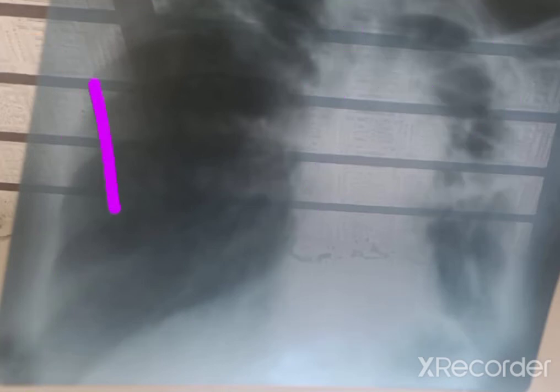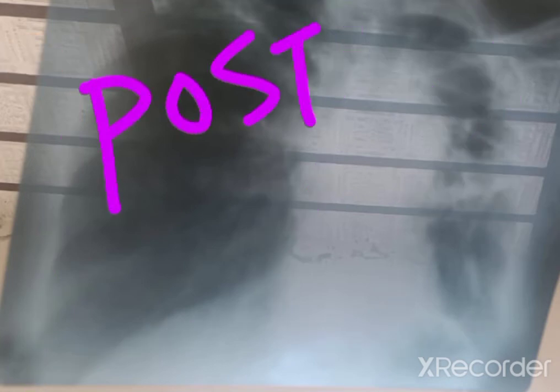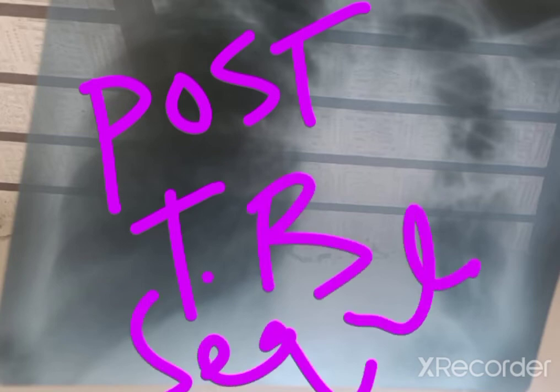If there is lung volume loss with fibrotic band, some cavitation in the left upper lobe, and hyperinflated lung on the other side with tubular heart, this is an x-ray of post-TB lung. This is post-TB sequelae.